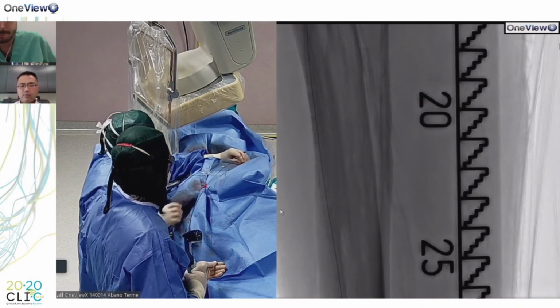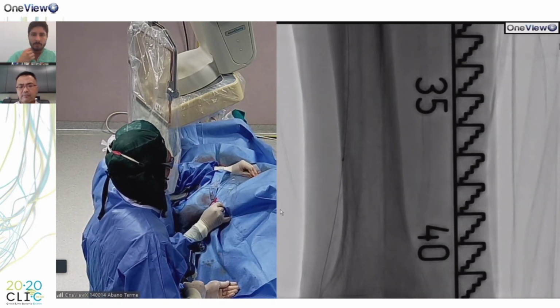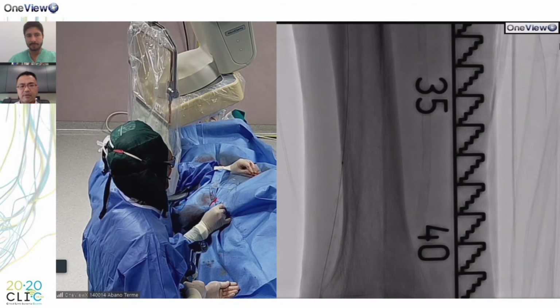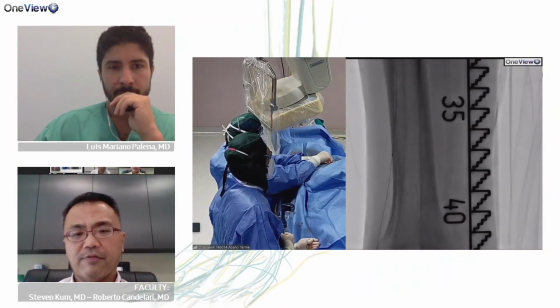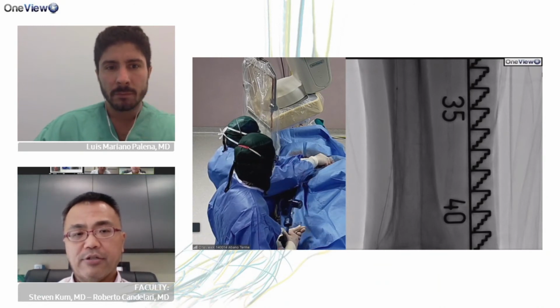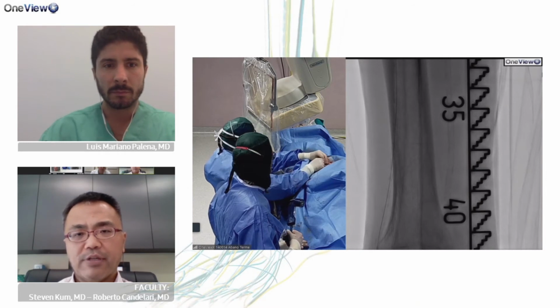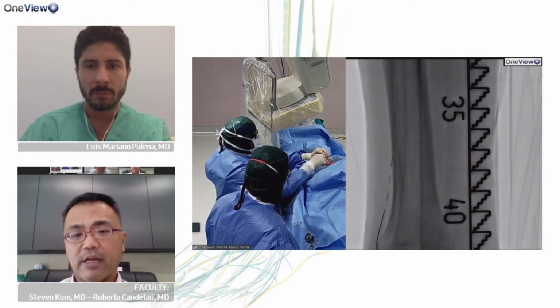Marco, you probably agree with me. I think when we started doing high pressure balloon angioplasty, as well as yourself, in combination with some nerve anesthesia, we were able to be more aggressive with balloon angioplasty to get lumen gains. So I think the combination of nerve anesthesia, which is very safe, will allow us to do what we need to do to get lumen gain below the knee.